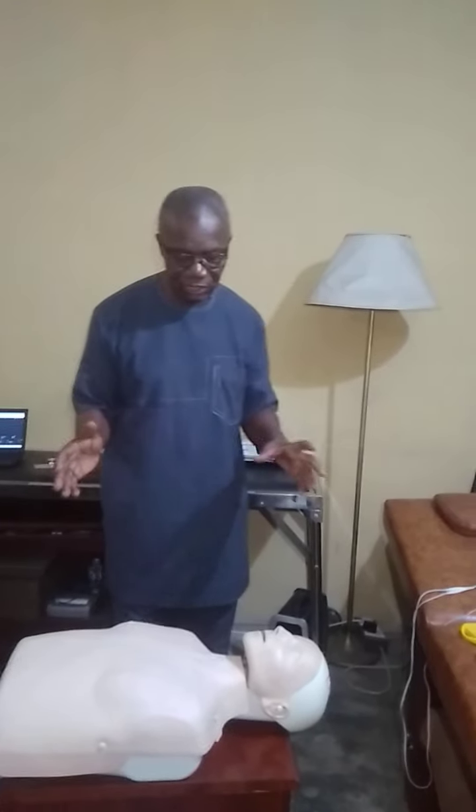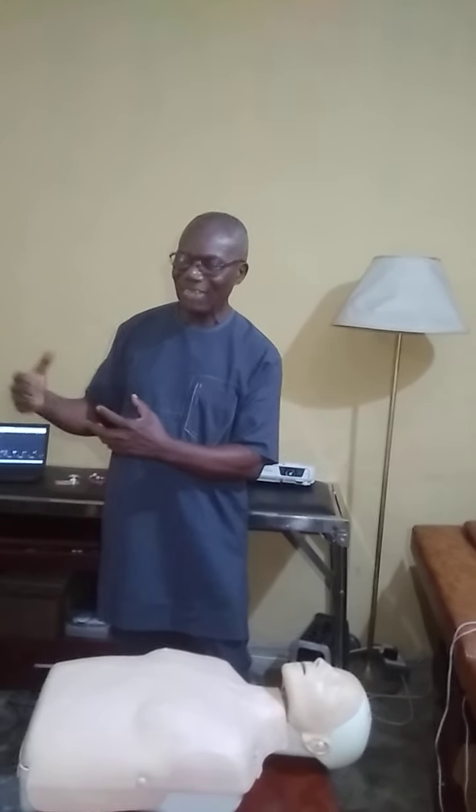Now, the first thing that you do before you even touch the victim is, if there's somebody around, you quickly ask the person to call the emergency number in your area, 911, 999, 112, so that help can arrive. And at the same time, you ask the person to get an AED machine. Remember, I talked about AED, defibrillator.